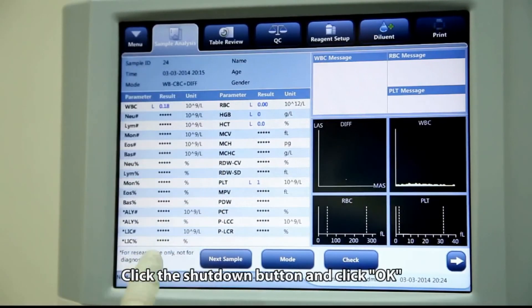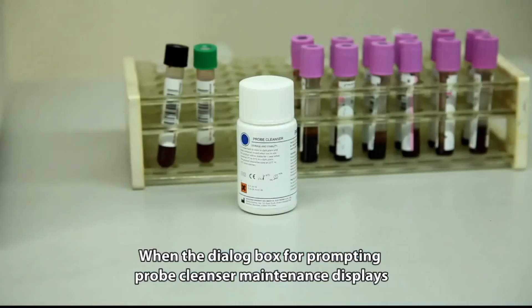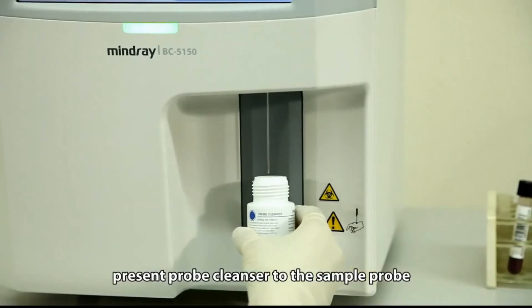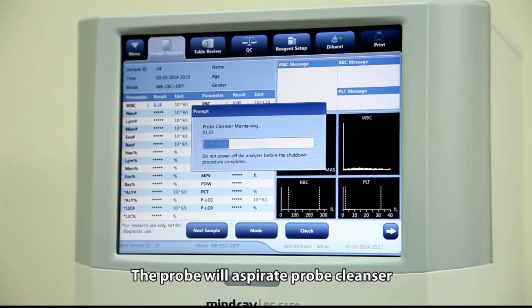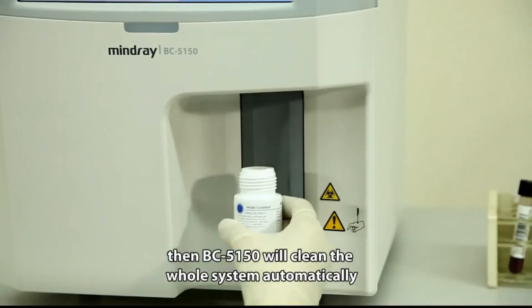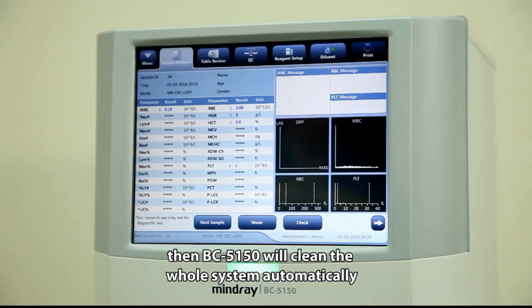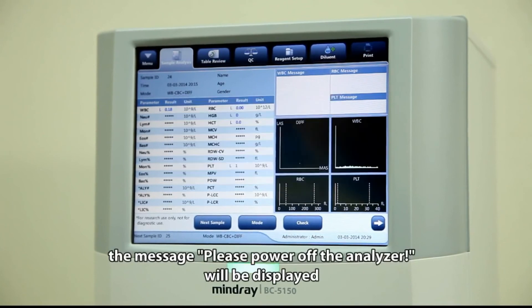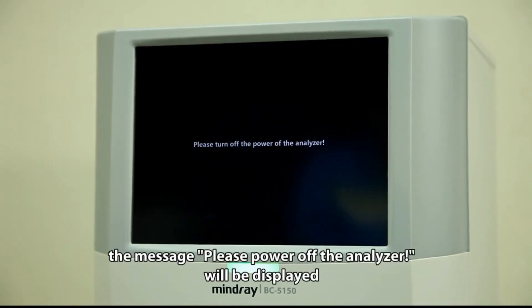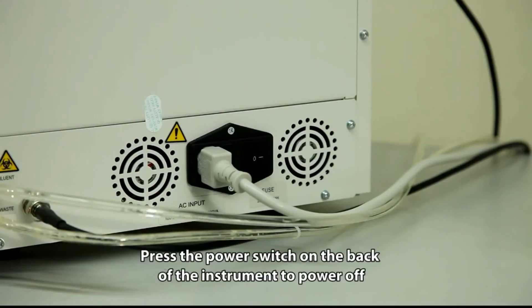Click the shutdown button and click OK. When the dialog box prompting probe cleanser maintenance displays, present probe cleanser to the sample probe and press the aspirate key. The probe will aspirate the probe cleanser, then BC5150 will clean the whole system automatically. After shutdown finishes, the message 'Please power off the analyzer' will be displayed. Press the power off switch on the back of the instrument to power off.